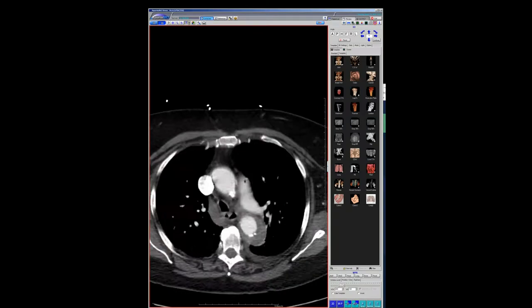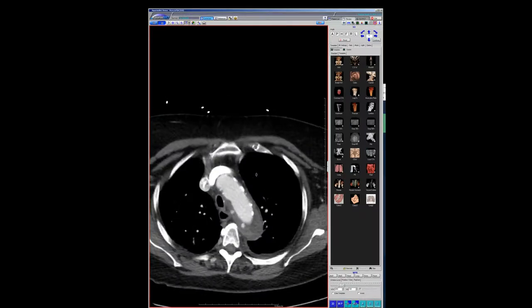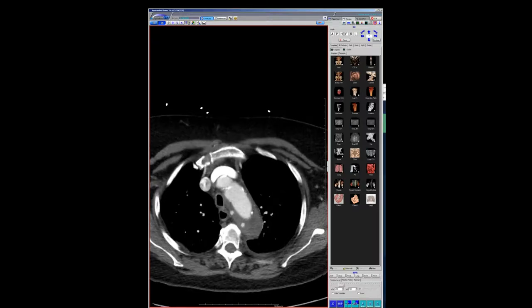Yeah, exactly. So Seth, what is the pathology here? Is it that these are damaged vessels, or are these just vessels that are starting to get reperfused as the hematoma shrinks or something like that? From my understanding, they're actually small pseudoaneurysms along the insertion points from these bronchial or intercostals, along their attachment points to the wall of the aorta, or where they arise. That's my understanding. Maybe someone else has a better understanding.